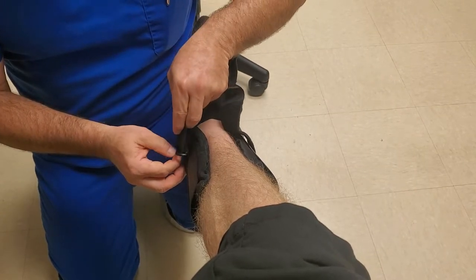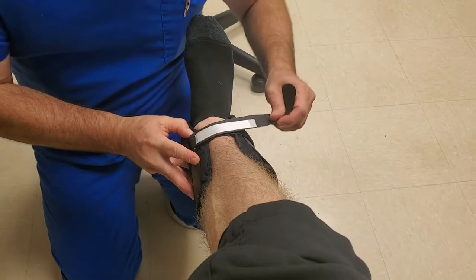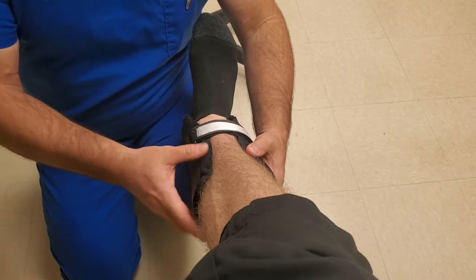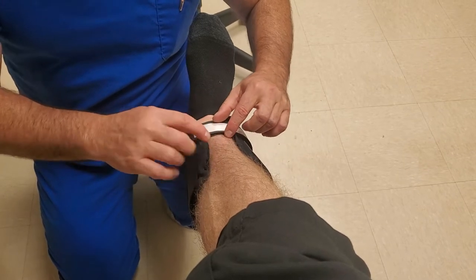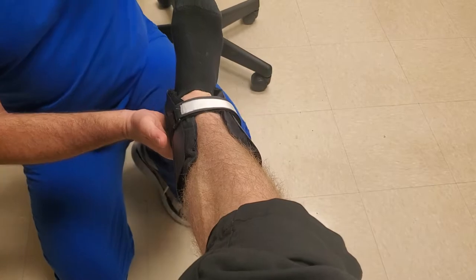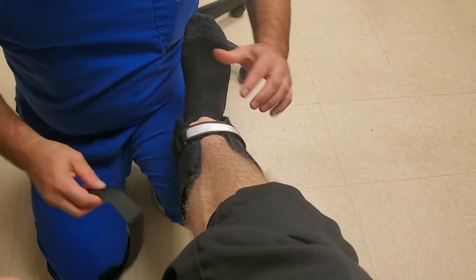You can recommend to the patient, or the parent of the patient, to have the patient wear either a long sock underneath, or if they want to wear some tights or yoga pants, so that these little straps don't rub marks into their flesh. Have the patient keep their foot mildly flexed so you get a better fit.